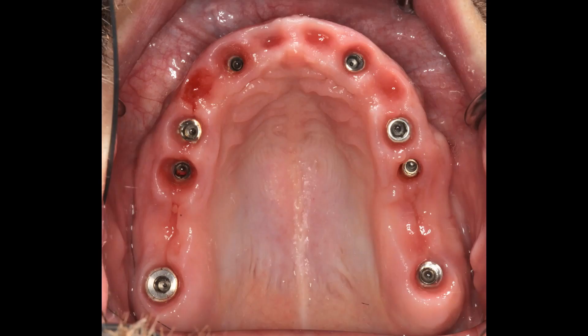One more picture of the soft tissues developed over the six months of treatment. This makes me extremely happy when I see tissues respond so favorably. You can imagine how life-changing these treatments are for our patients. It doesn't just change the patient's life — it changes our lives too, because we're so happy to be able to give patients outcomes like this.